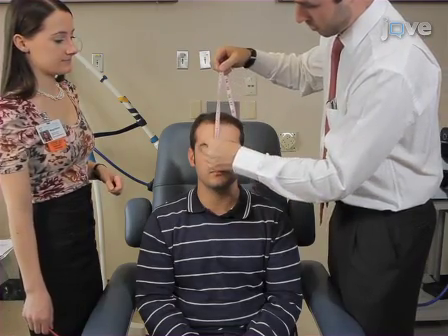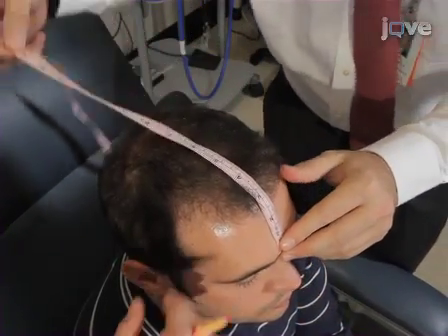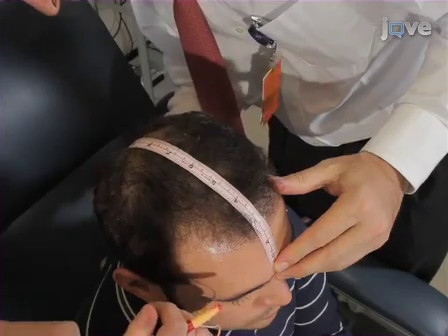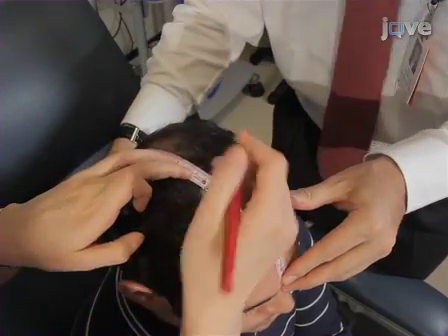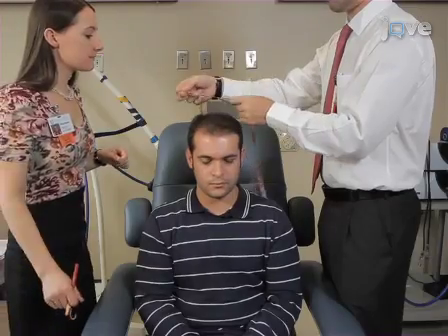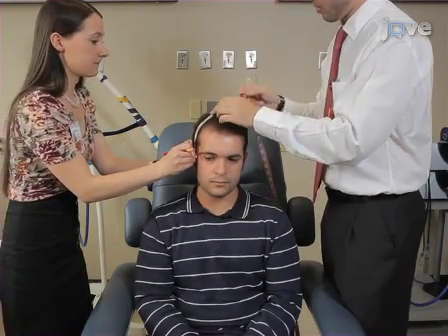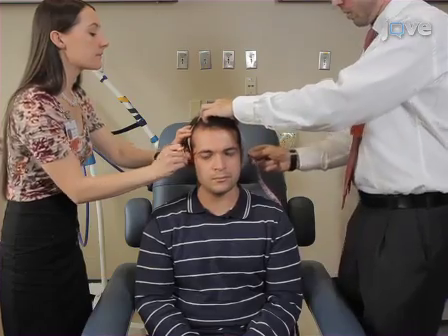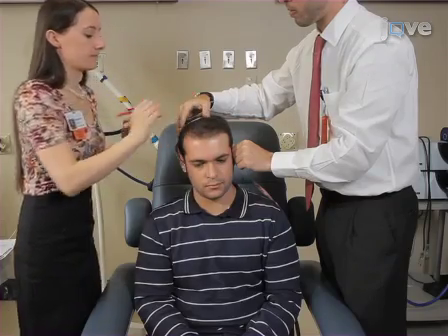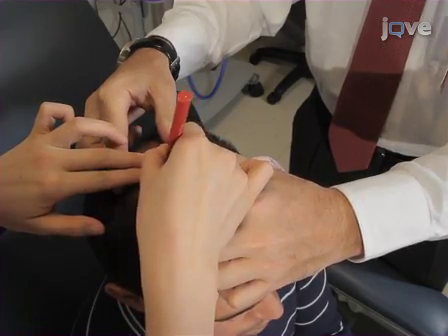To localize the vertex, first measure the distance between the nasion — the point between the forehead and nose at the junction of the nasal bones — and the inion, the most prominent point of the occipital bone. Mark the point halfway between these locations using a skin marker. Next, measure the distance between the preauricular points, being sure to place the tape measure over the marked nasion-inion halfway point, and mark the point halfway along this auricular line. The intersection of both marked points is the vertex.